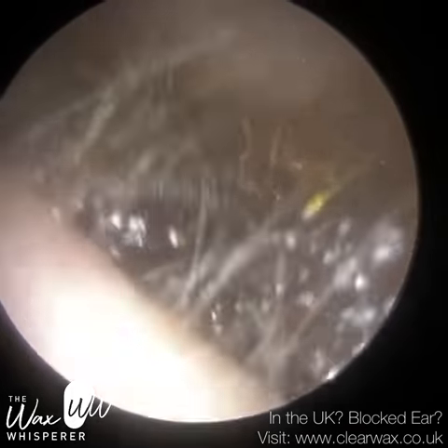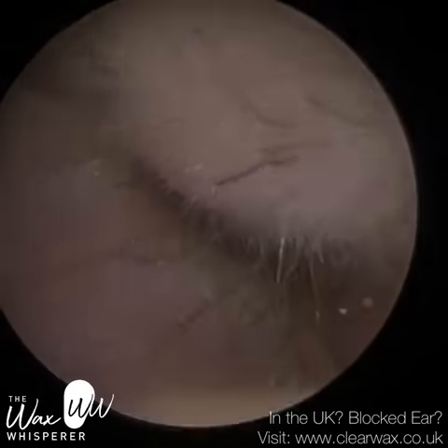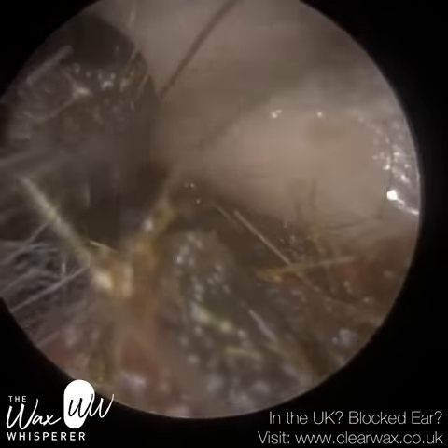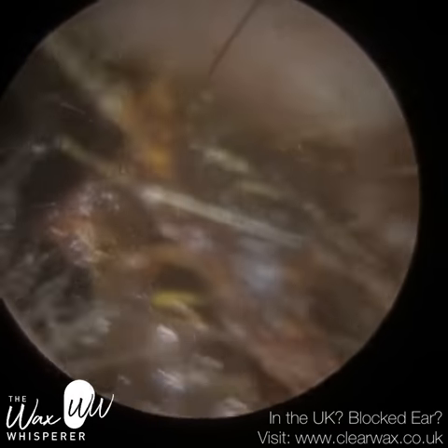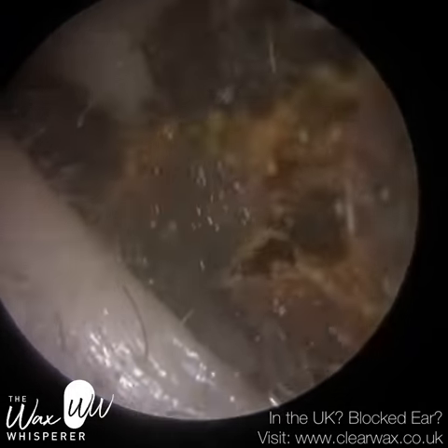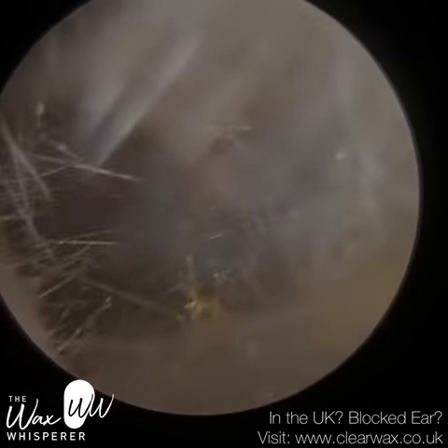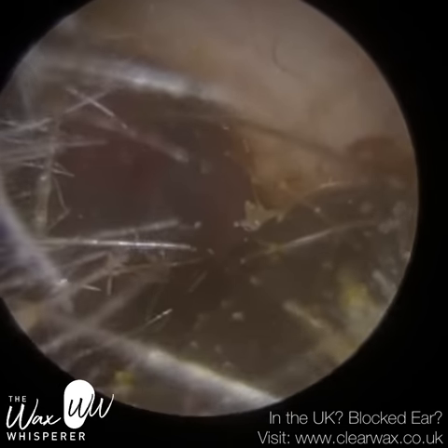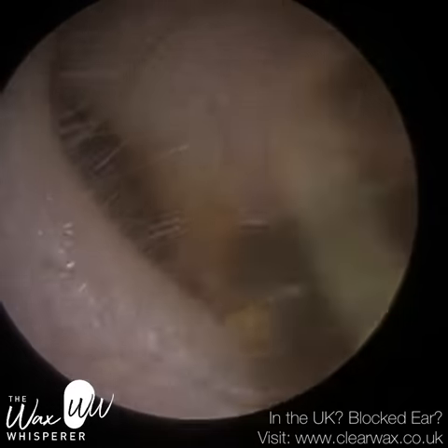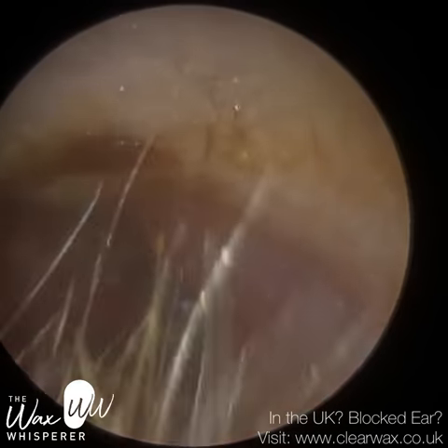I'm going to get this out in three segments overall. The entrance was a bit narrow as I'm bringing the wax plug out — it's getting trapped near the entrance. This wax on screen now is actually visible externally. So if you were stood beside the patient, you would have actually seen this wax hanging out of the ear. Again, just using the Jobson horn — you can see the gaps are a bit bigger, so I'm going to use the Jobson horn to get in and behind and just gently leverage this out. This is the big piece, and I've got a still image of it.